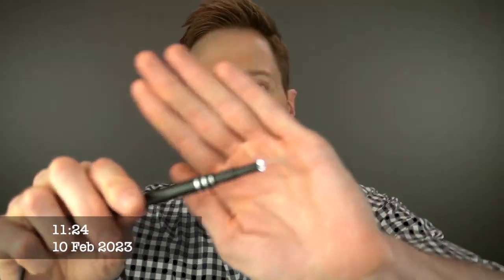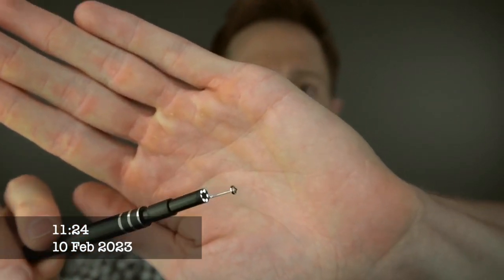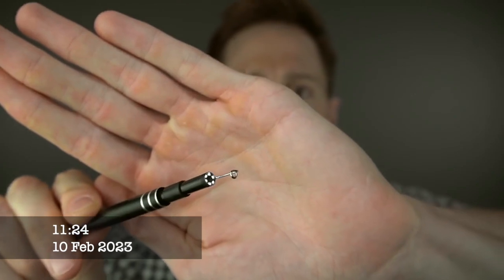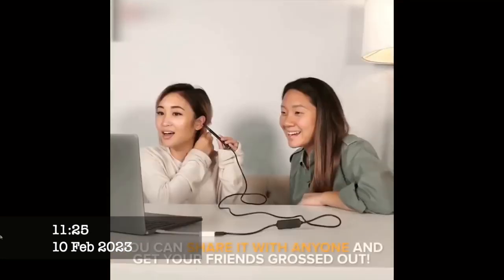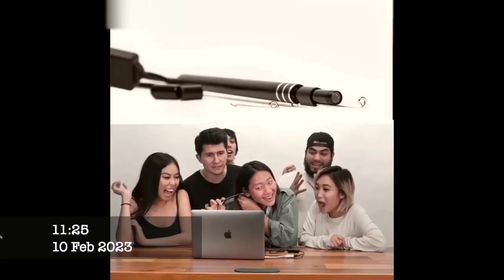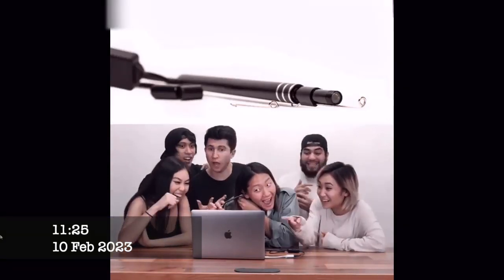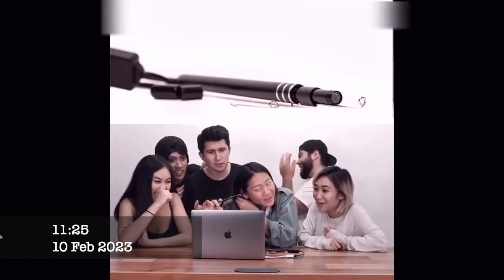Basically, a video endoscope is a camera that has a little light on the end of it. These devices are designed to light up your ear canal, and then they attach these little wire loops on the end that you can use to try to dig the earwax outside of your ear canal. Many of these companies show videos of successful earwax removal. Now, I think removing earwax is satisfying, but the actors in their videos are absolutely having a blast using this tool. I mean, they're basically having an earwax removal party.